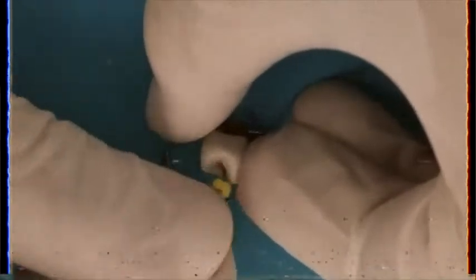Reaching now to our master apical file, which is size 50. With this size 50, we can now do the final reshaping, final circumferential filing, and also check for the apical constriction.